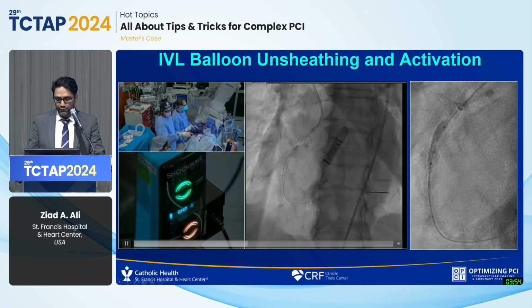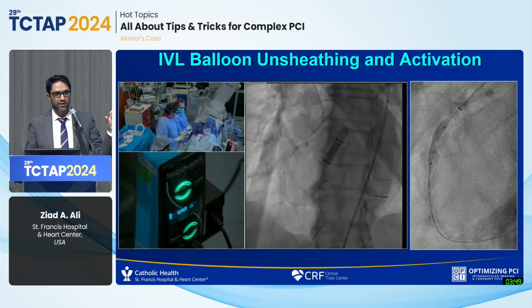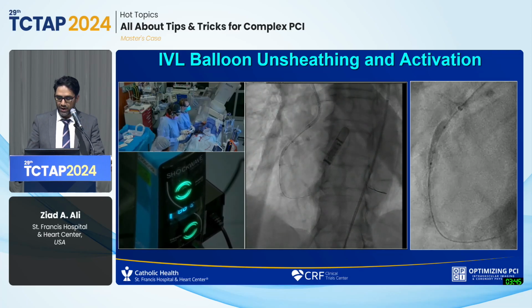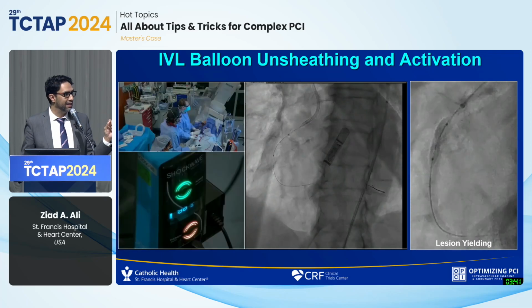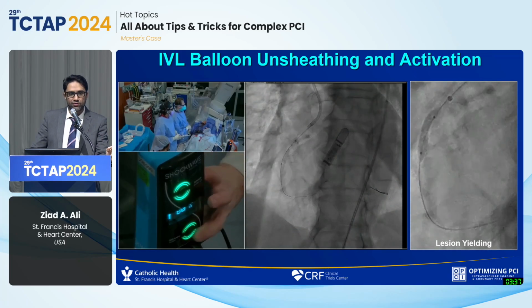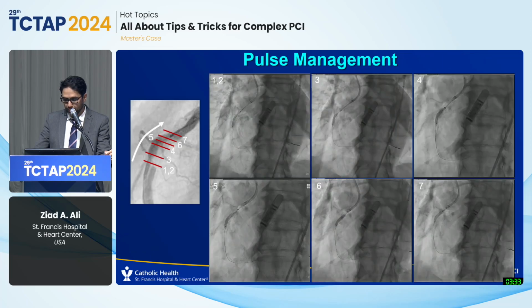The first thing that you'll notice when you start to use IVL is there's no aha moment. There's no pop like there is with a non-compliant balloon. Instead, please look on the right panel. You see a very subtle but immediate change in the ratio of the wire, which is centrally placed, to the balloon expansion on the side. So this is a much slower progress.